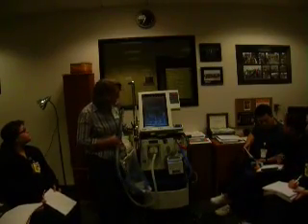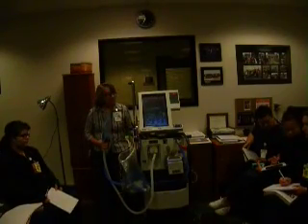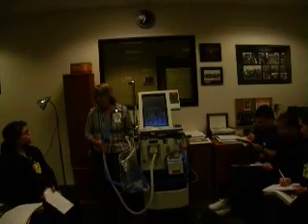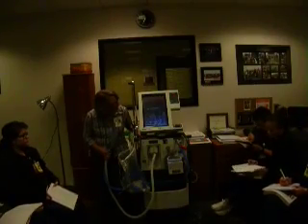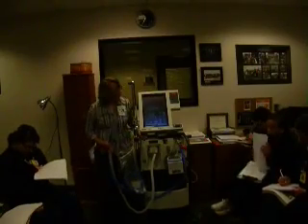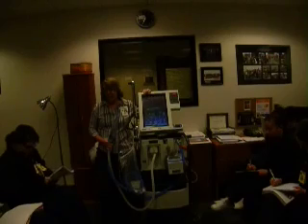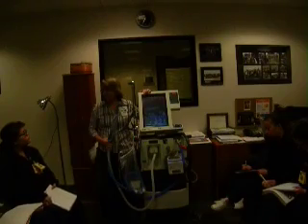So for our alarms, this ventilator, now every vent, the actual alarms that you can set are different as well. Some have more than others. Some automatically set alarms based on the parameters that are set, and you don't have to set it, like it'll automatically put the low pressure below 10. Some you have to set every single one. So on the Puritan Bennett, here's all the ones down here that you can set. So there is a high pressure. High pressure alarm is typically set 10 above wherever your PIP or peak is averaging, never more than 35. You'll see it more than 35 in the clinical setting, but it shouldn't be more than 35. You increase your risk of barotrauma.